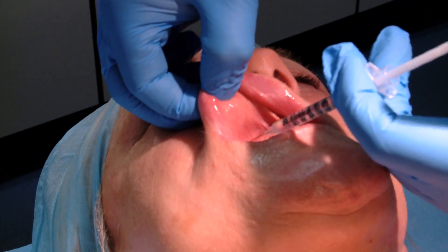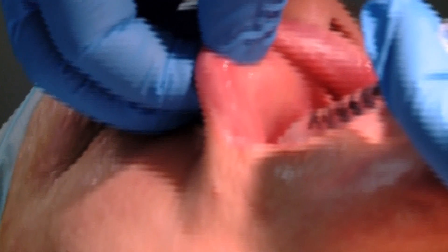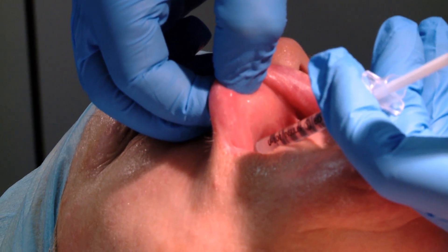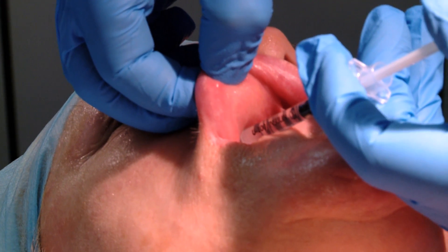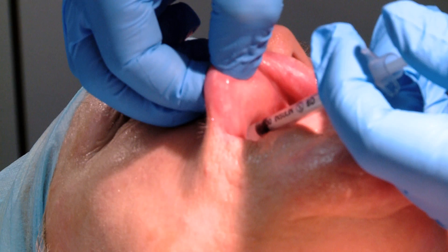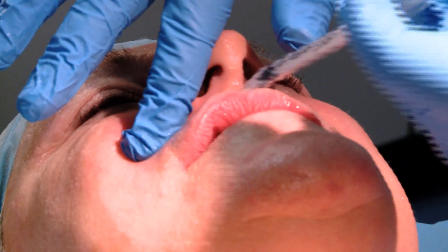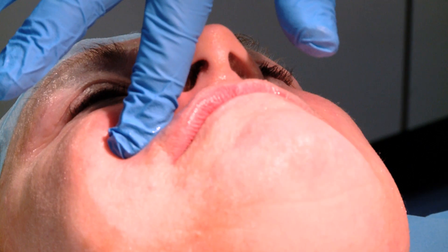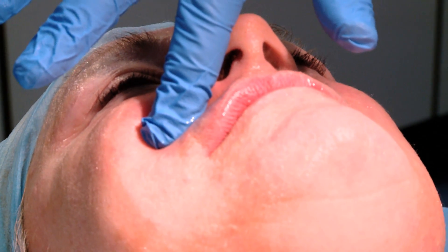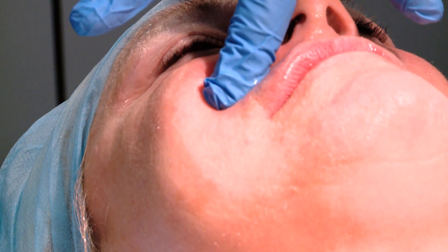We can see this little frenulum that exists at the edge of the third tooth. I pull the skin down over the needle, which doesn't tend to hurt the patient as much. The infraorbital nerve comes out through a little foramen just underneath the eye, and I hold the anesthetic for a moment, allowing it to infiltrate back into the foramen for better lateral spread of the anesthetic.